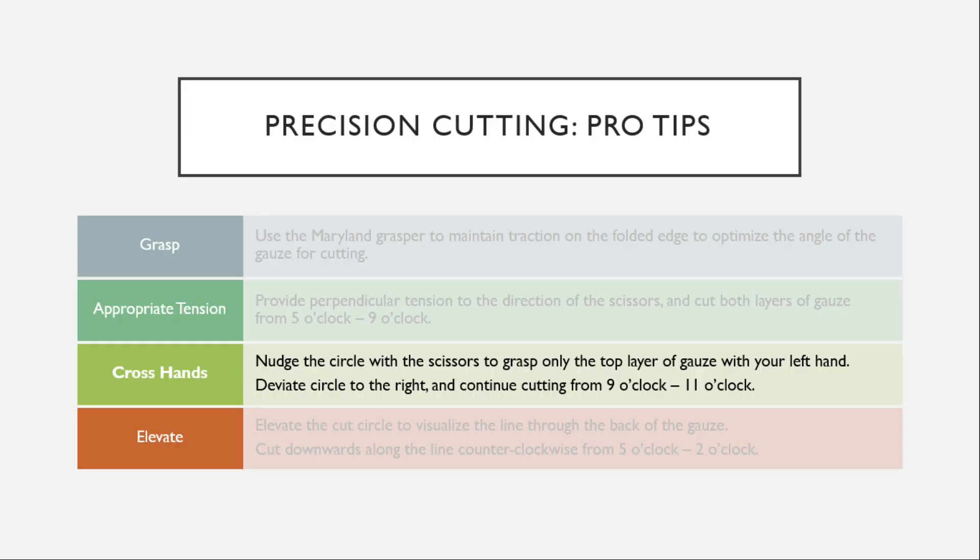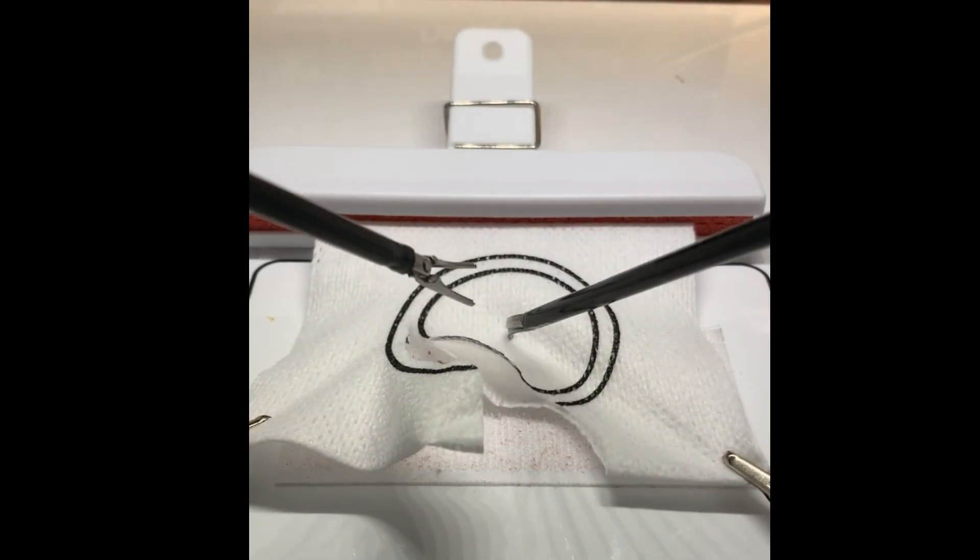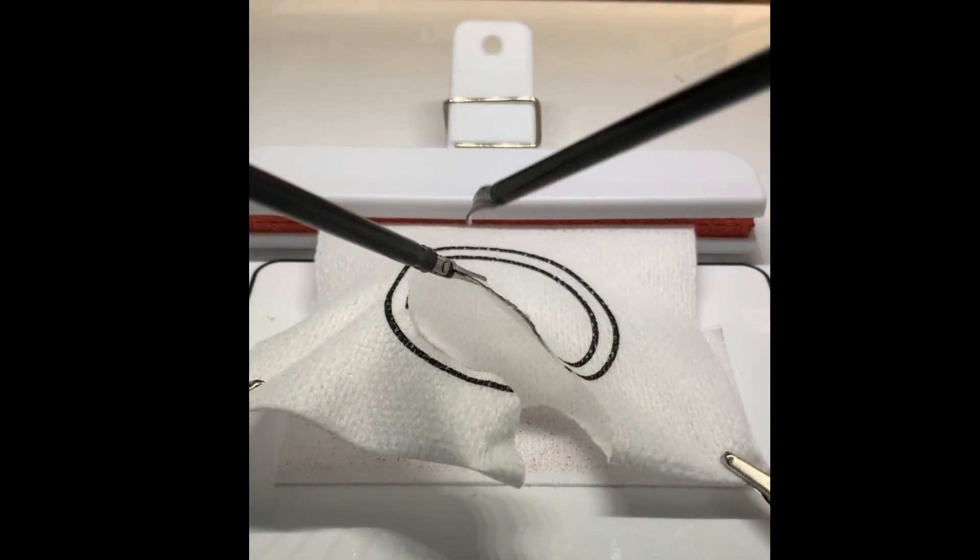Next you're going to nudge the circle with your scissors to grasp only the top layer of gauze with your left hand. You're going to cross your hands and deviate the circle to the right, then continue cutting from 9 o'clock to about 11 o'clock.